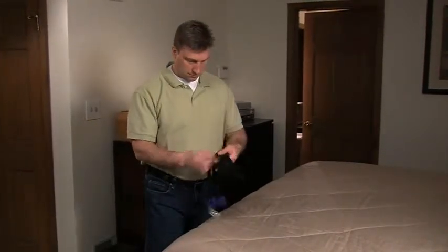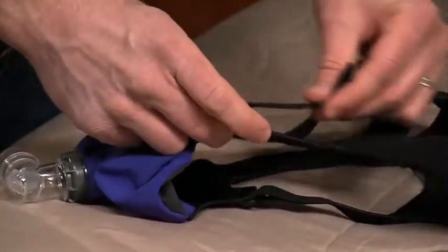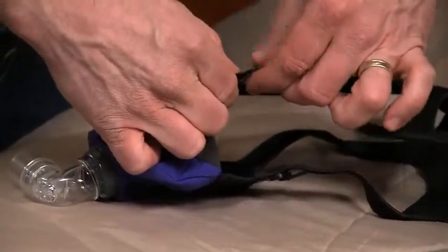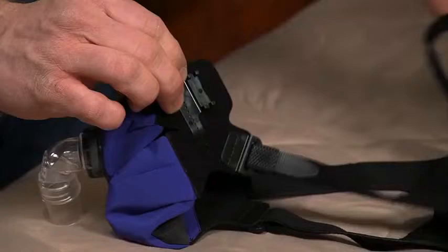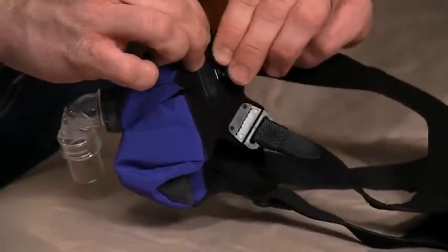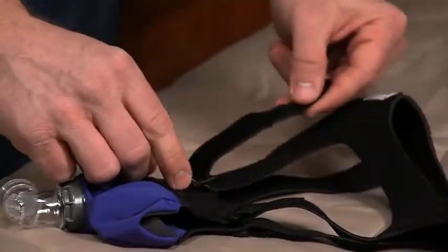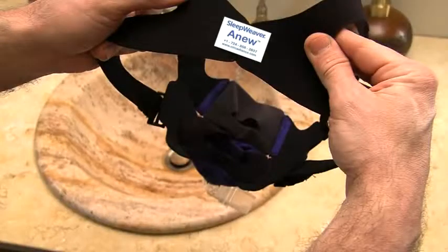Make sure all hook tab straps are attached to the headgear with all strap lengths at their widest settings. The two bottom straps come with a plastic double clip attached to the hook tabs. Simply snap the male double clip into the female quick release clip on the mask, making sure each side is firmly attached. Hold the mask and headgear with the bottom of the mask facing you; the label is located on the outside back of the headgear.